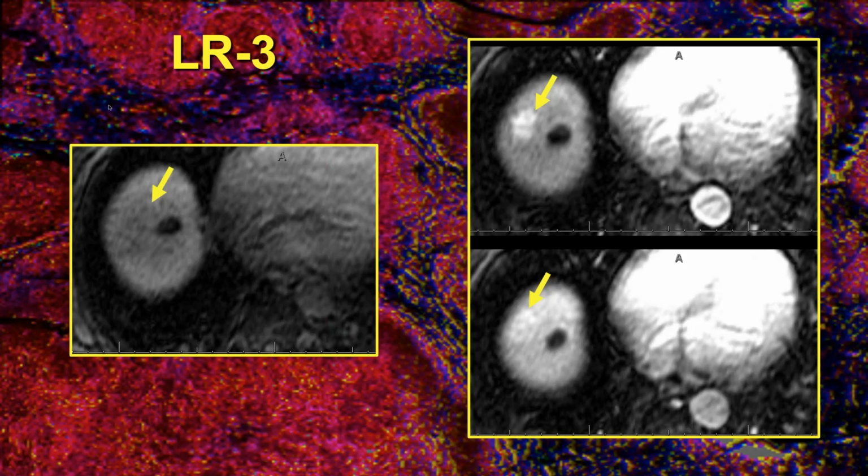So a key thing when you see hyperenhancement, especially at the periphery of the liver, does it look like a lesion or a pseudo-lesion, or a nodule or a pseudo-nodule? And this indeed looks like something is there, and that's why it was called LI-RADS 3. Notice for convenience, it's right next to a cyst. So this is going to help co-register the images on subsequent imaging.